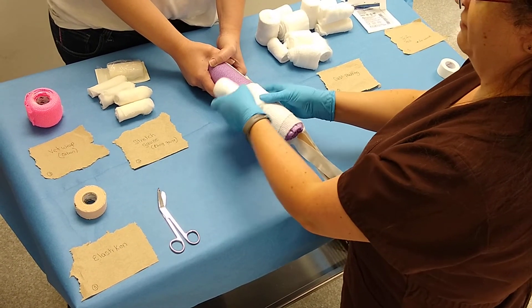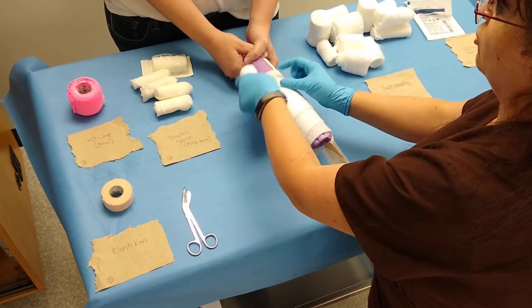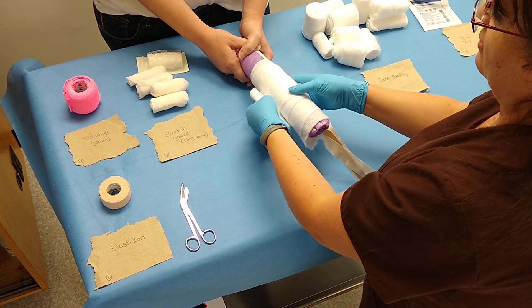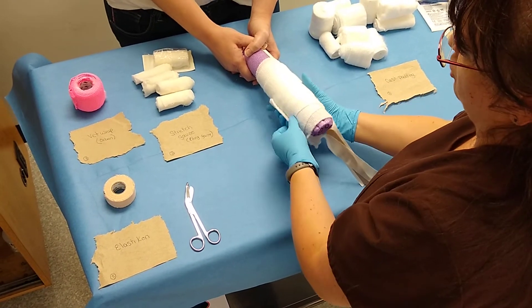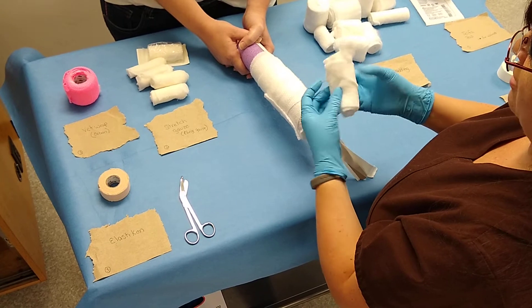You're going to overlap about 50%. With a regular Robert Jones, you're applying a huge volume of cotton because you want to immobilize a fracture. This modified version does not have as much padding, because you still want some immobilization but the fracture is not a complete fracture.